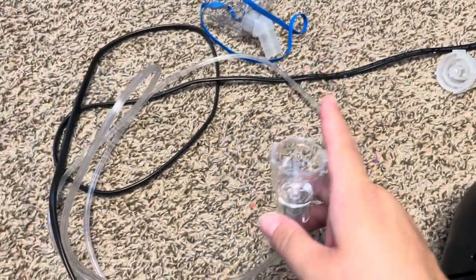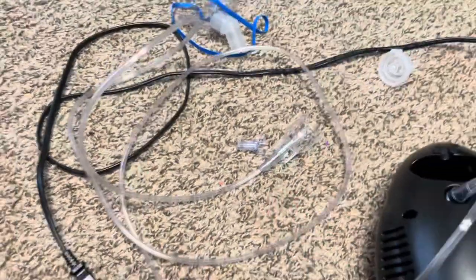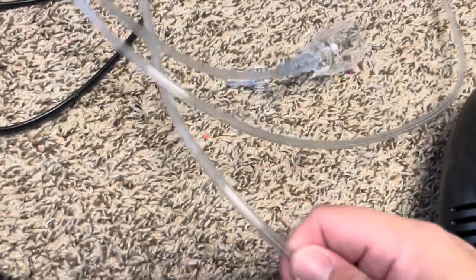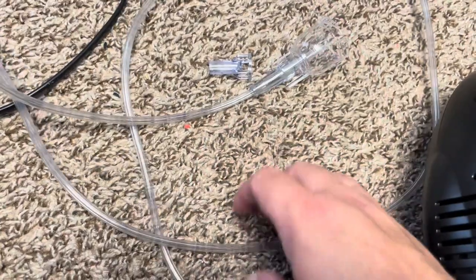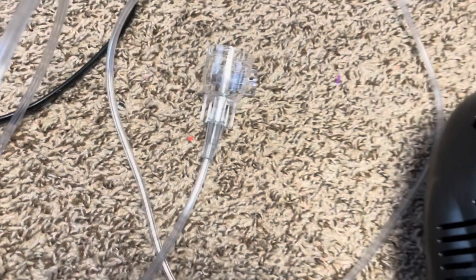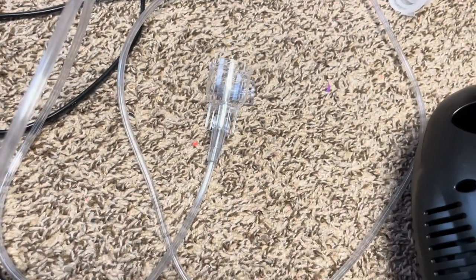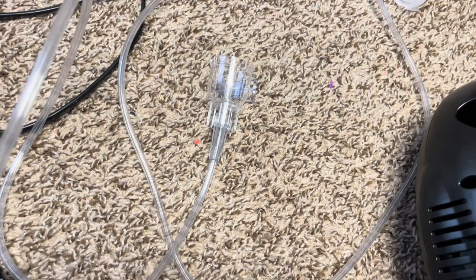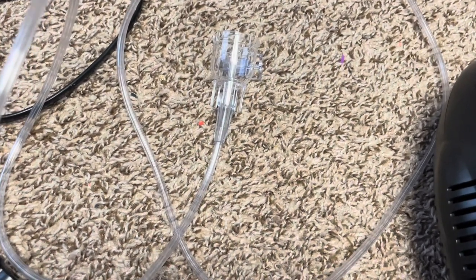One important thing: don't put water in the tubing. Back when I first got this, I thought you put water in the tubing to clean it — no. You put the mask parts in hot soapy water and leave them to air dry. Don't put water directly into the tubing, because that can cause mold and mildew.